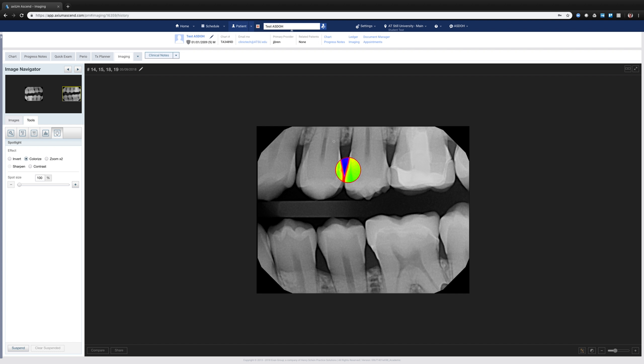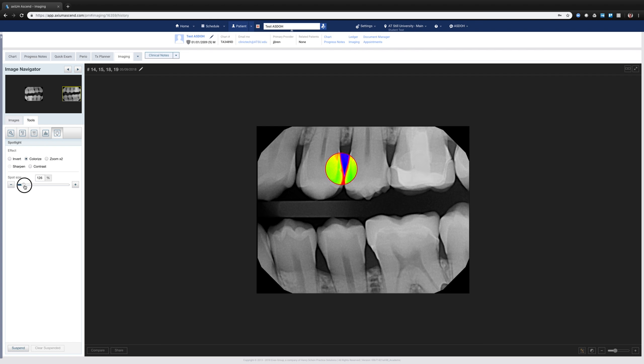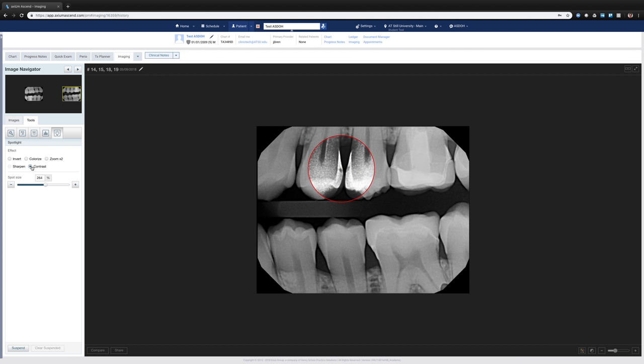I can colorize, sometimes it's easier to see that way, or I can also change the size or scope of that spot tool.